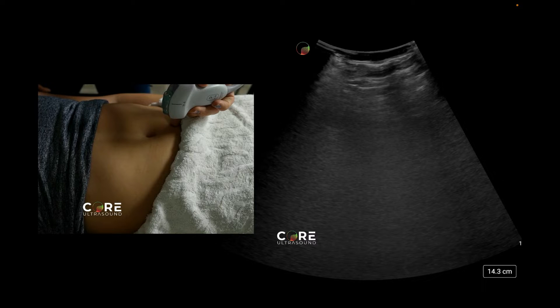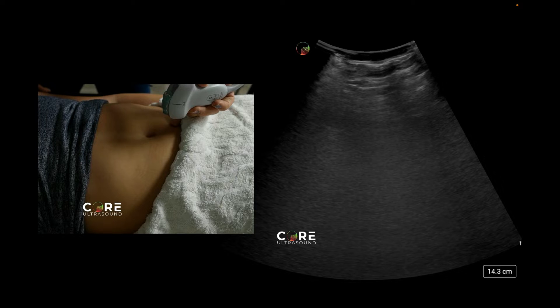With regards to technique, make sure that you place a towel overlying the pelvis. Typically what I do is ask the patient if they can tuck the towel into their pants and underwear, and this is to avoid getting gel on your patient's clothing.